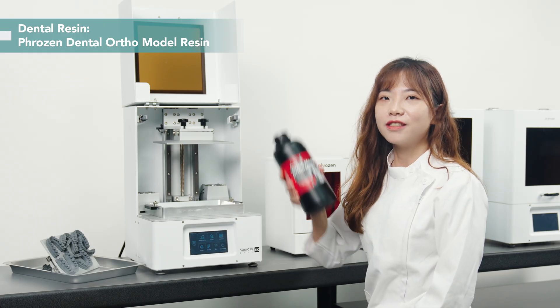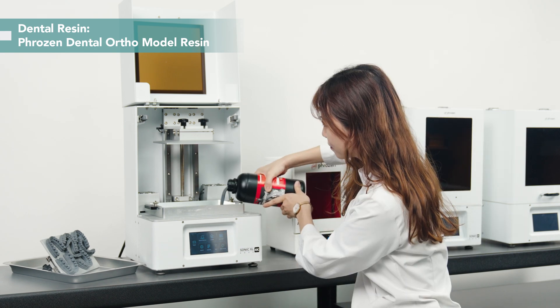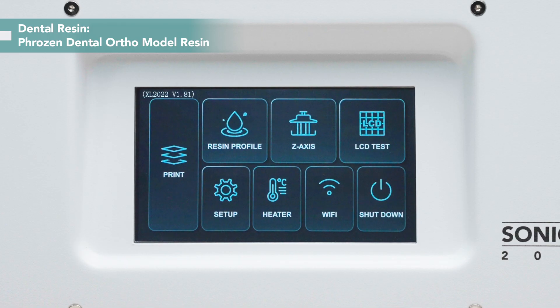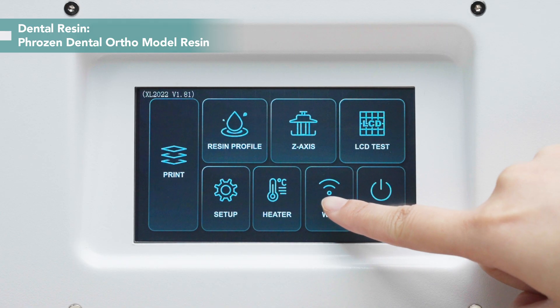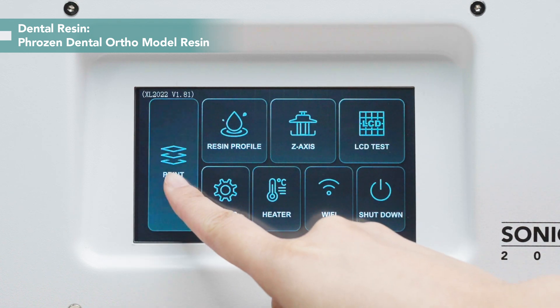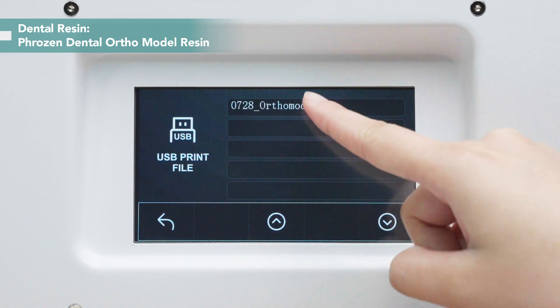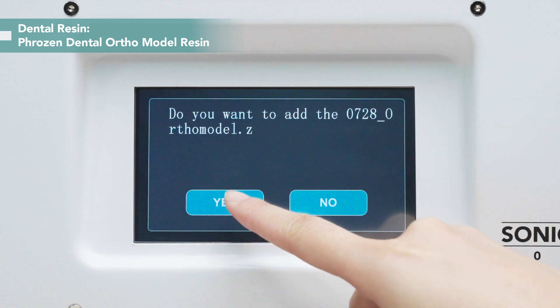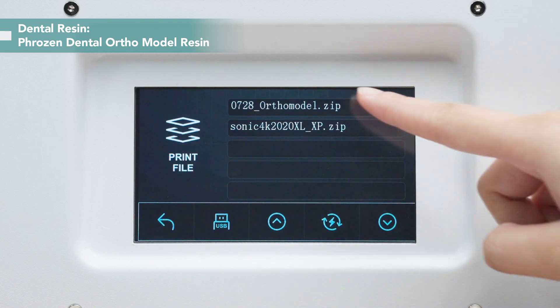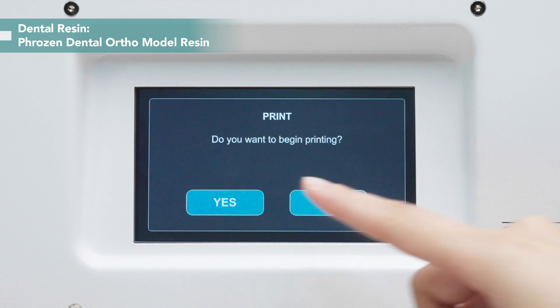Don't forget to give the resin bottle a good shake before use. For importing the printing files to the printer, you can use USB or Wi-Fi. We'll use USB to import our files. Now everything's ready — let's print.